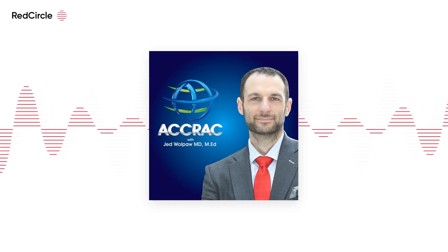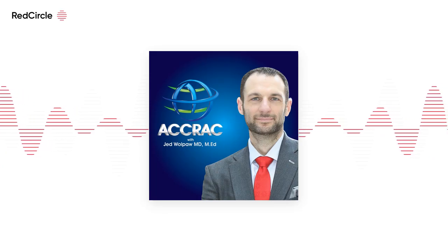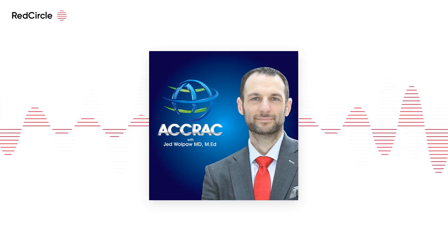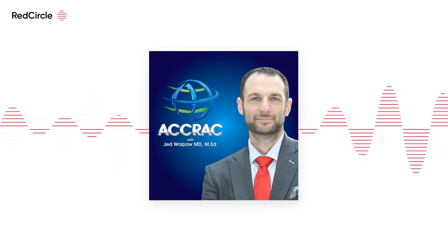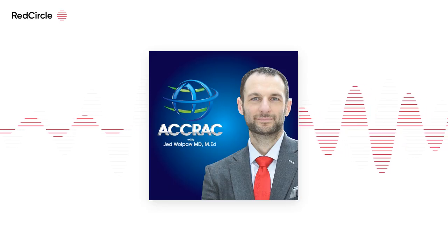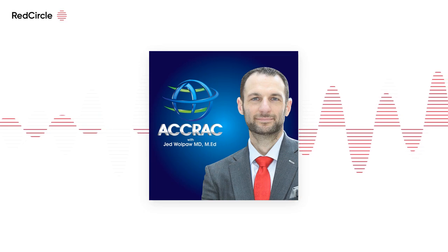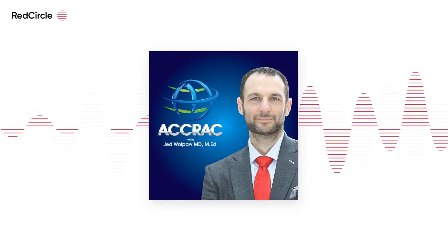What it does is inject this electrical signal from the first pair of electrodes, and then send it to each pair of electrodes. So let's say you had 16 and 1. It's going to send that signal from 16 and 1 to 2 and 3, and 3 and 4, and 4 and 5, to each pair of electrodes. When it does that, it's measuring the impedance, which is just the resistance, and it's measuring the impedance of air. So in a breath, of course, the impedance of air is going to change drastically during inspiration and expiration.